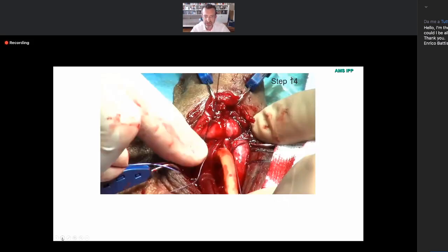You can close the corporotomy, as you see in the slide, and take out the orange silicone part that is around the tube. It's better not to leave it in place because it does not give you any advantage and can produce some problems, especially if you have any postoperative complication and you have to recheck the patient. Go ahead, next slide, please.